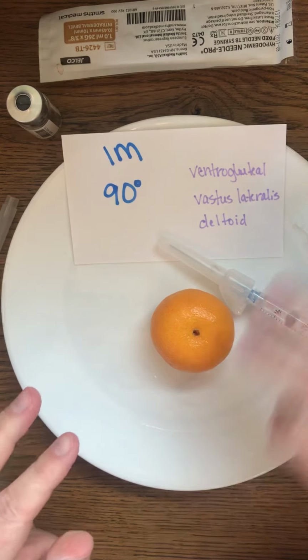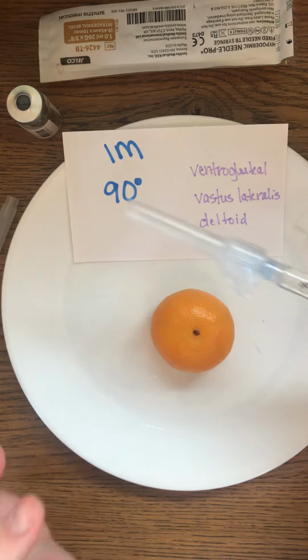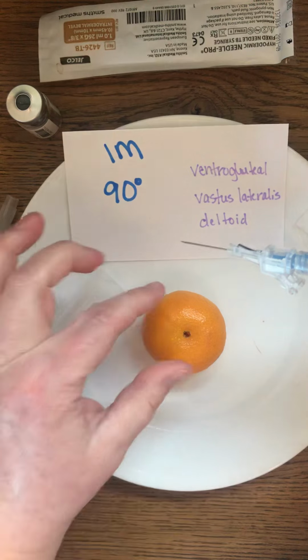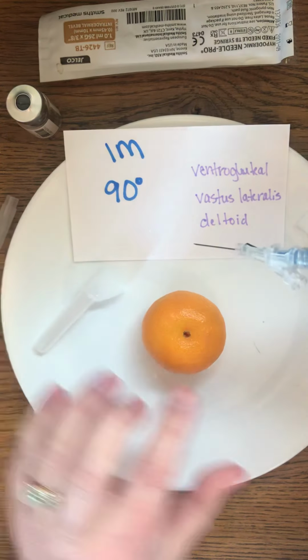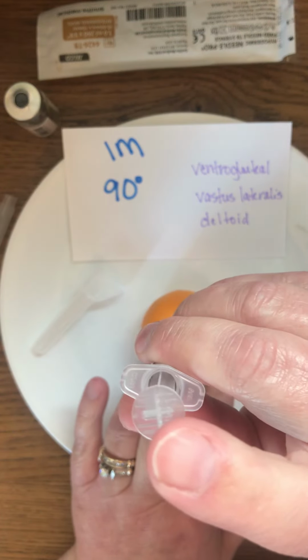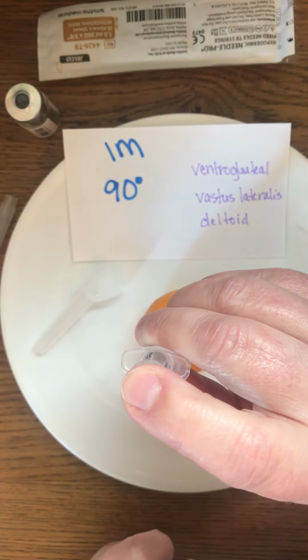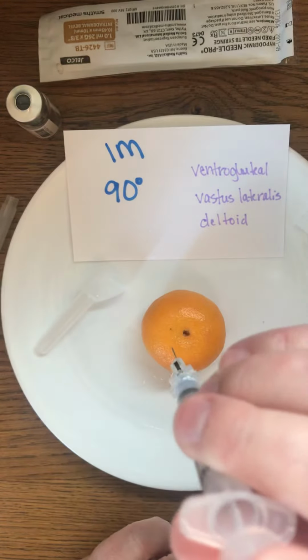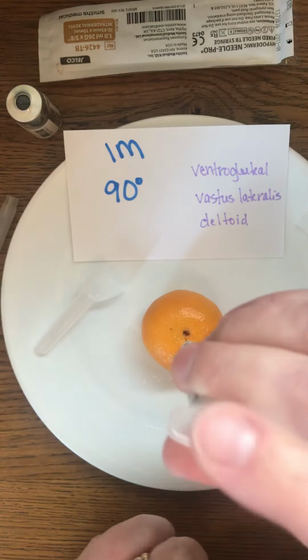All right, so I've already done this. I've cleaned my skin, I've cleaned my site, I've checked all my stuff. And again, it's going to be really hard to show that Z-track method on this orange. But if I were to do it, I would pull this skin down, or pull it this way, pull it taut, and then you're just going to jab in. You do want to do a rather quick jab and go through, and then when you pull out, pull straight out.